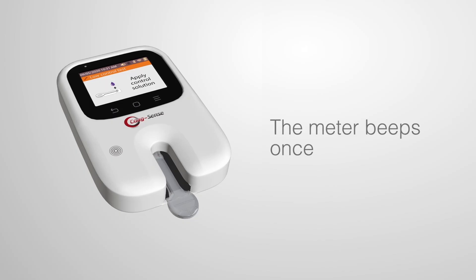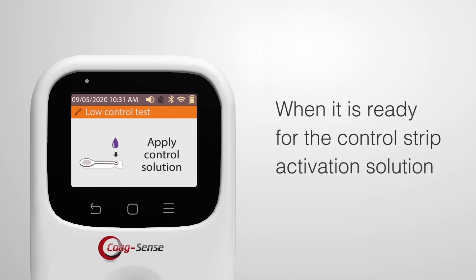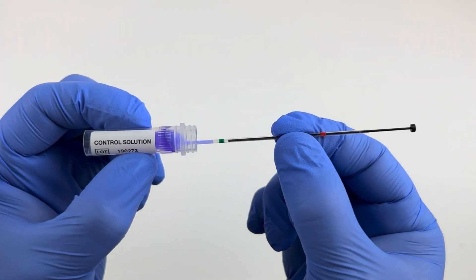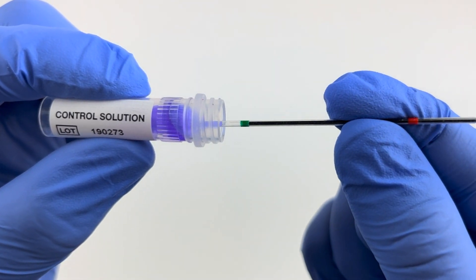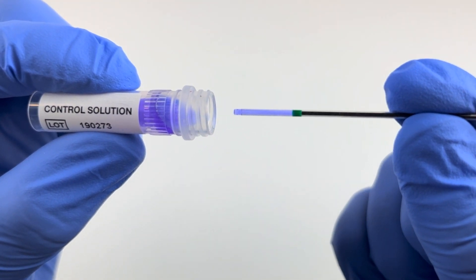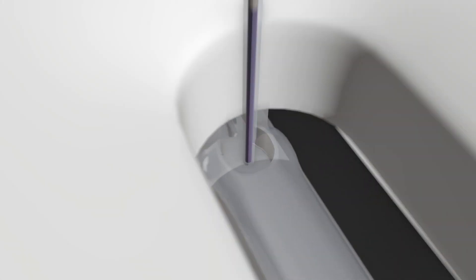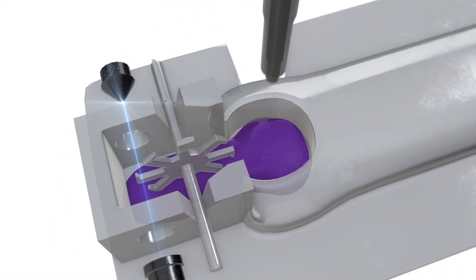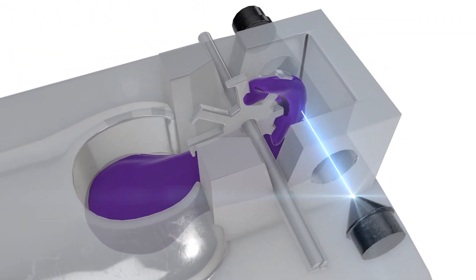The meter beeps once and displays 'Apply Control Solution' when it is ready. Insert the Transfer Tube into the Control Activation Solution and let capillary action fill until solution flow stops at the green band. Then insert the Transfer Tube tip into the sample application well of the test strip, touching the tip down at the flashing green light in front of the wheel.